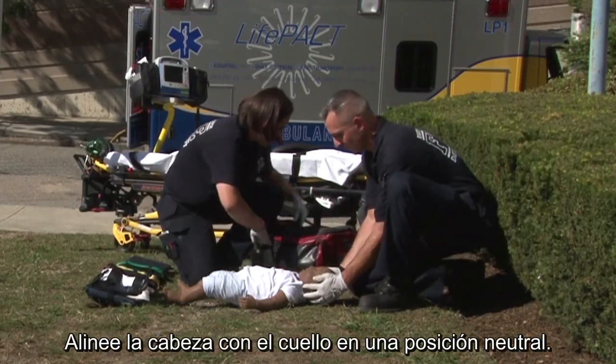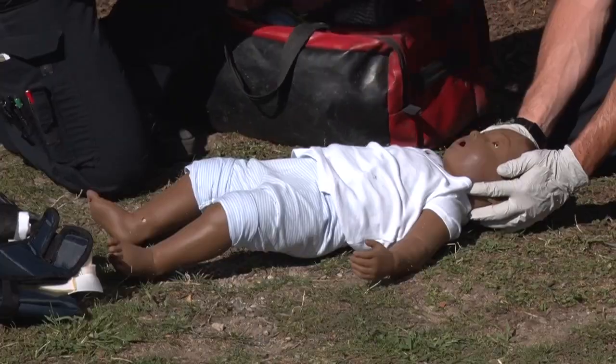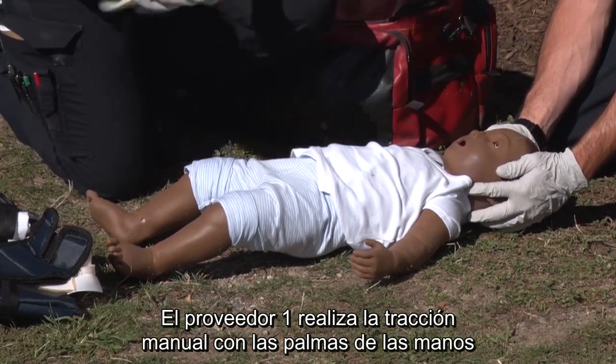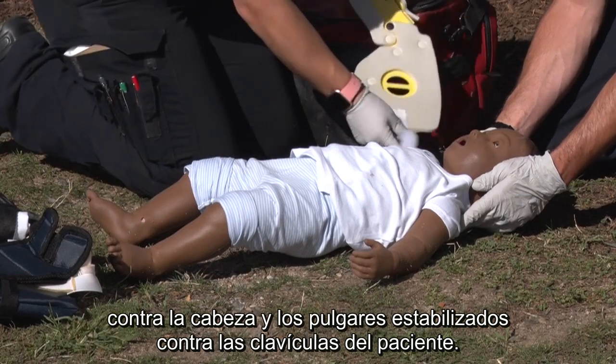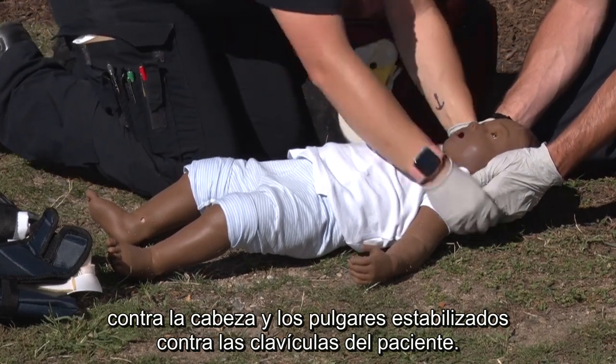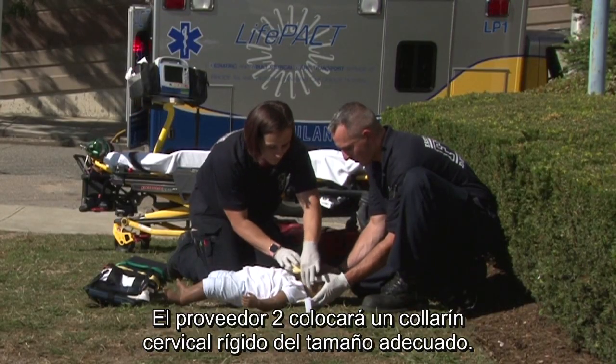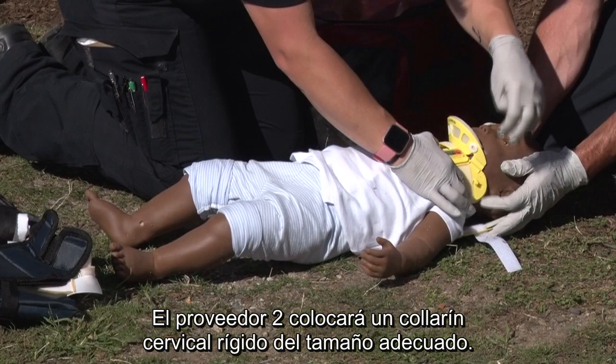Align the head and neck in a neutral position. Provider 1 holds manual traction with his or her palms against the side of the head and thumbs stabilized against the patient's clavicles. Provider 2 will apply an appropriately sized rigid cervical collar.